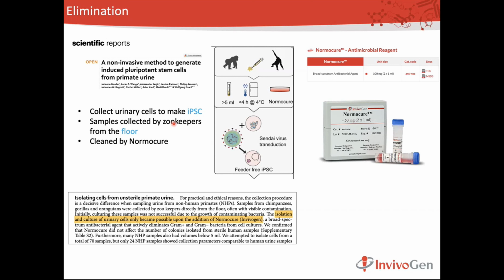So this is one thing, but of course, not many of you will work in this setup. But there's another quite common example that may suit you. Not only for mammalian cell culture, but let's say if you are working with fungi, you want to collect your special fungi sample from soil, from the ground.